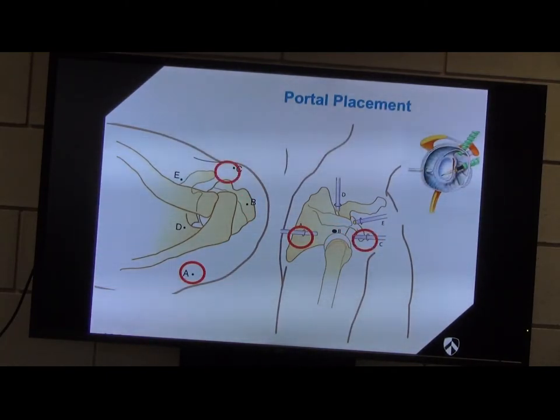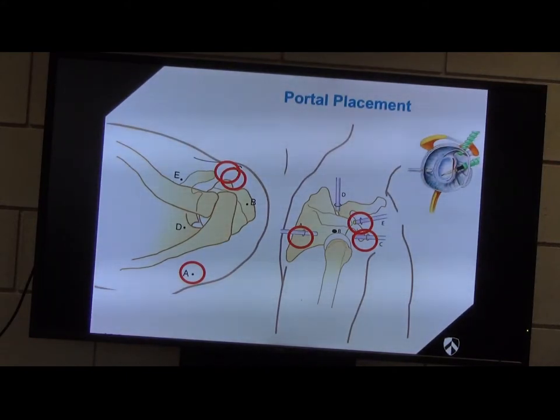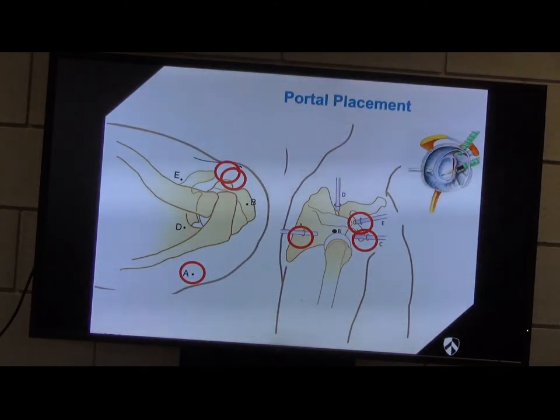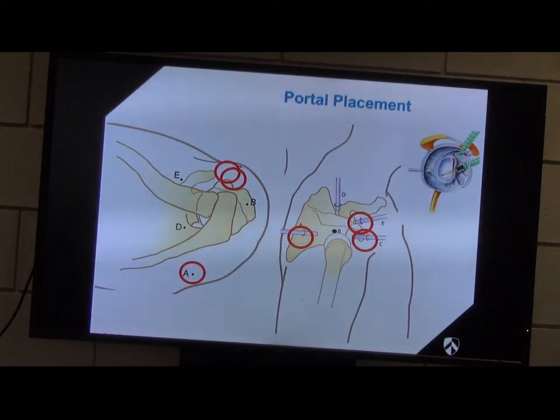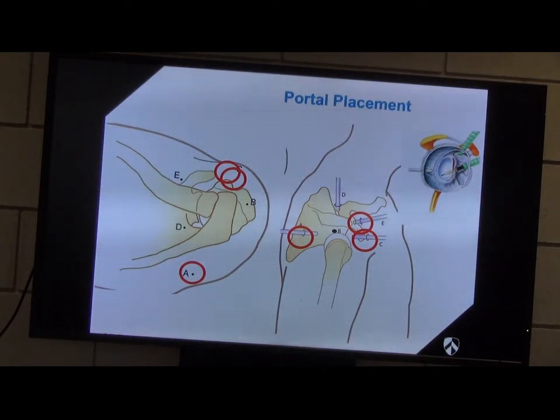Do you need to use cannulas? No, absolutely you don't. If you're doing a labral stabilisation, the standard portals will be posterior and then two anterolateral portals. One portal you tend to put in line with the glenoid, and the other portal you need to put more laterally so that you can fire your anchors into the glenoid face without them skiving off, generally speaking.